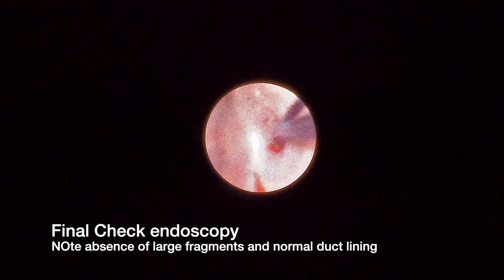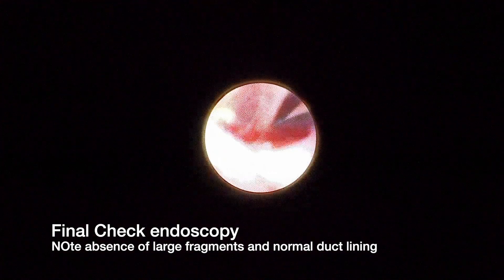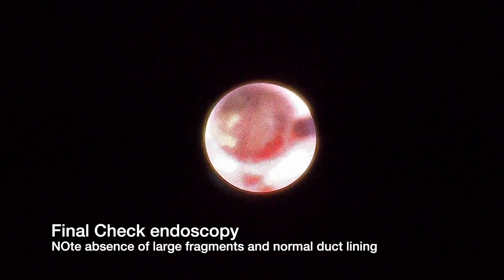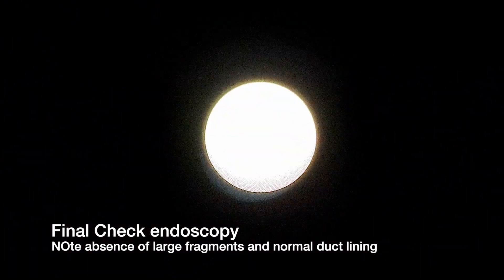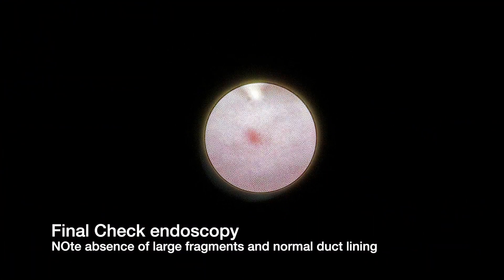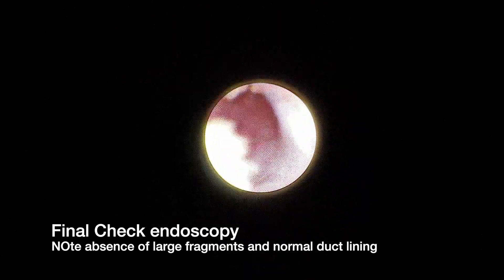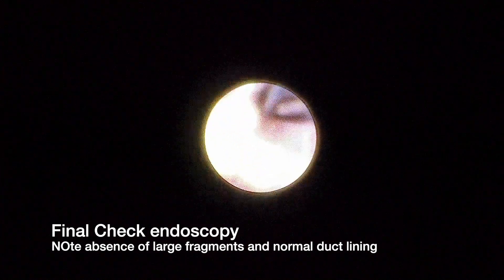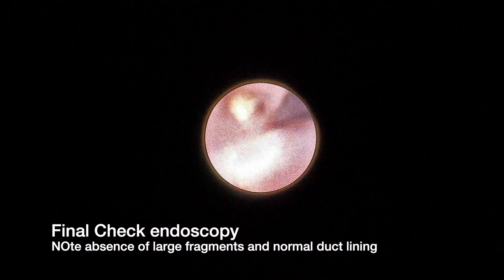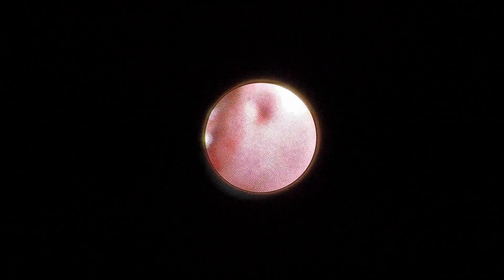At the end of the procedure you need to confirm that no large fragments are left behind and the duct is nice and healthy. This ensures good post-operative salivary flow and complete recovery for the patient. The very small fragments flow right out with the irrigation procedure and the duct is stented to complete the procedure.